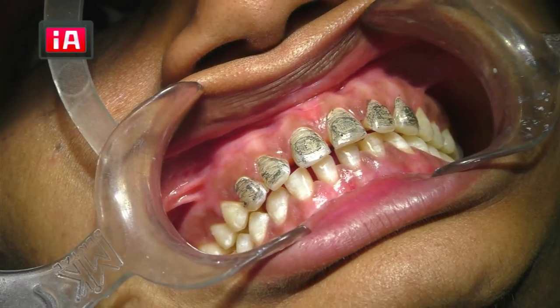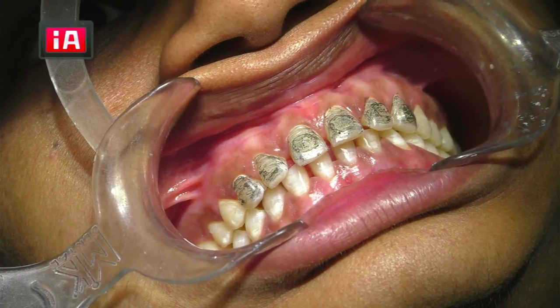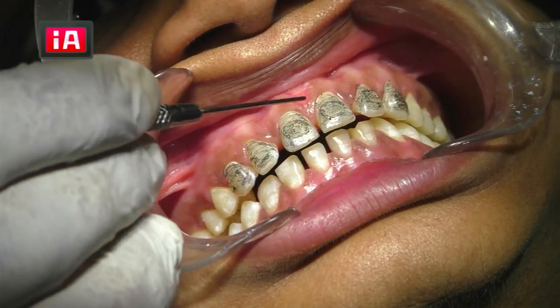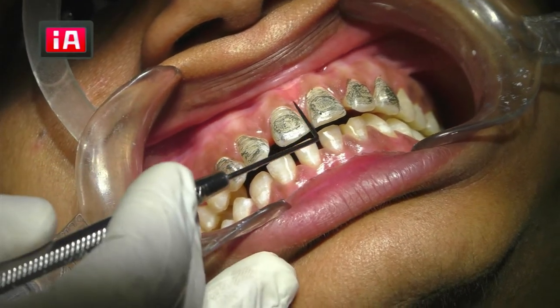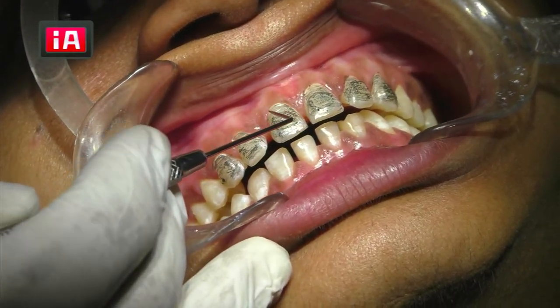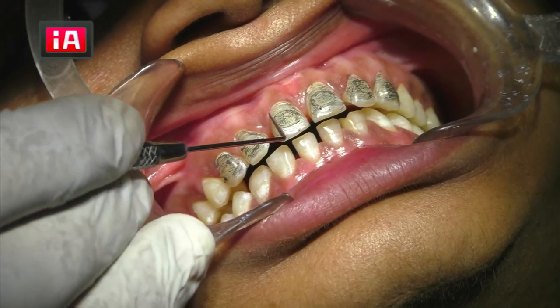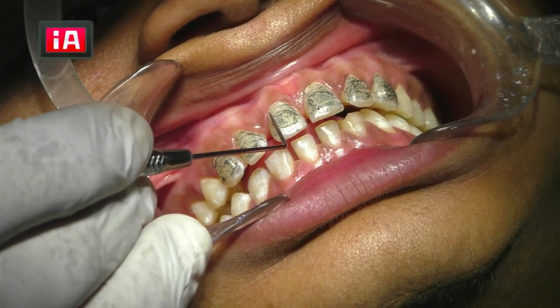Now, how will my preparation be? The preparation will start from here. Most of the time in conservative dentistry, we don't give a subgingival margin. We give an equigingival margin, or sometimes supragingival. So I'm going to give an equigingival margin. My preparation will go from here till here, just crossing.